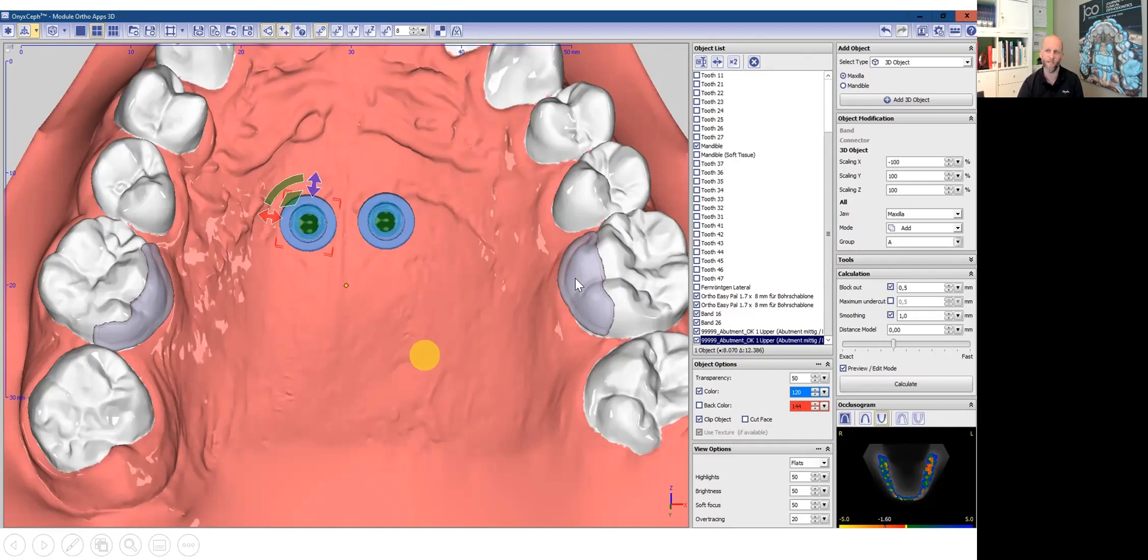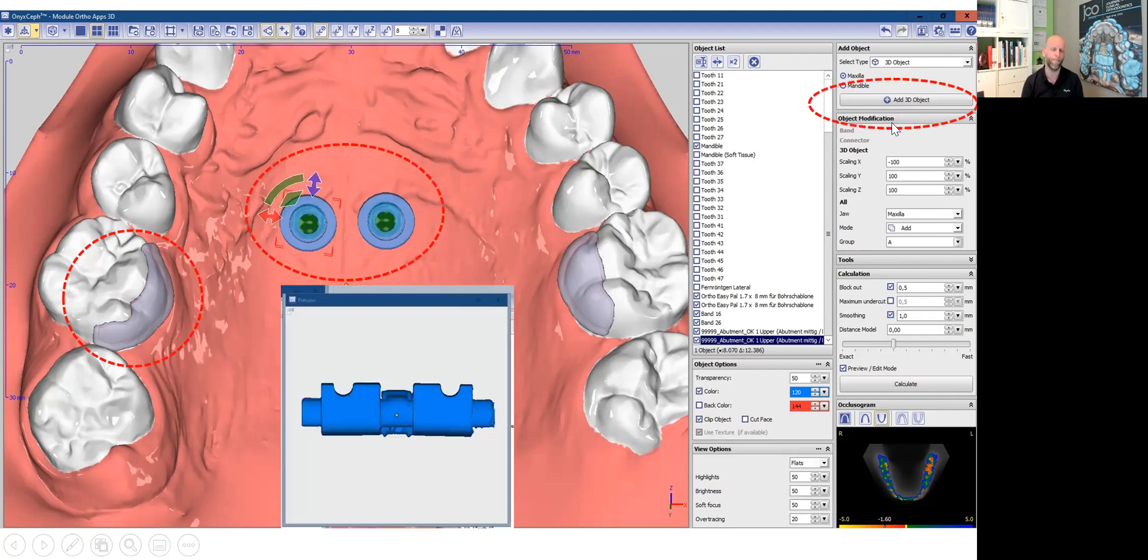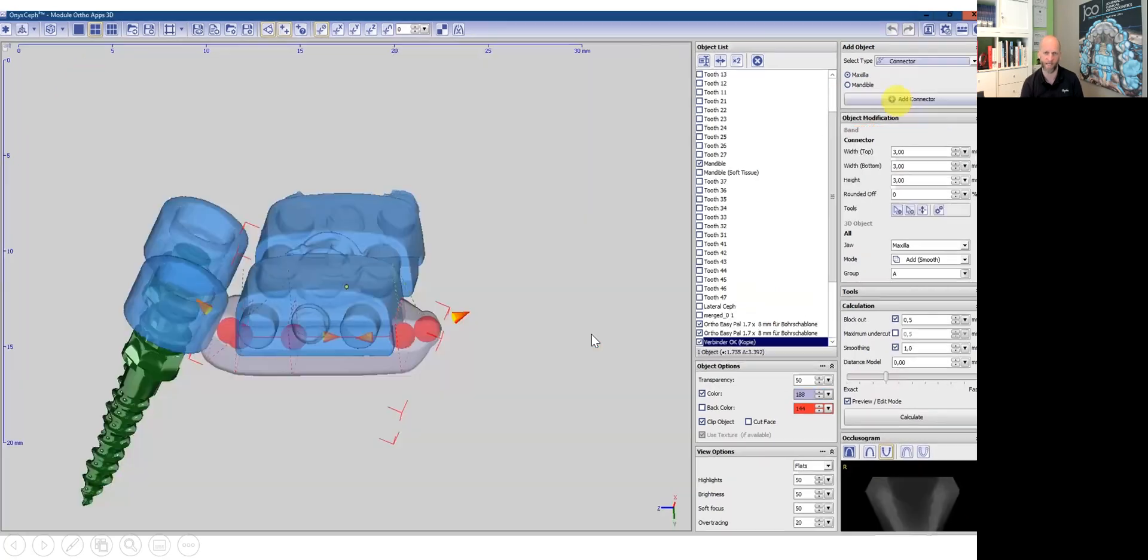So what else do we need? We need another 3D object. So we click on 3D objects. And what do we select? We select an expansion screw. There are many available. I selected a quite classical Hyrax expansion screw. And by clicking on the object, it's added.